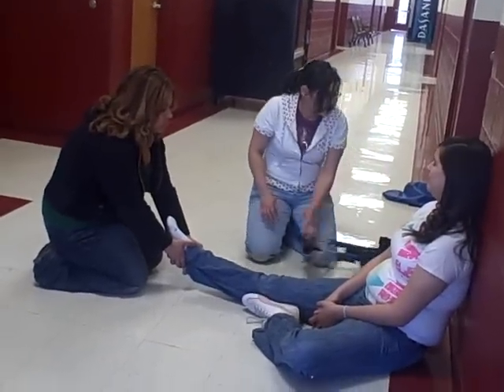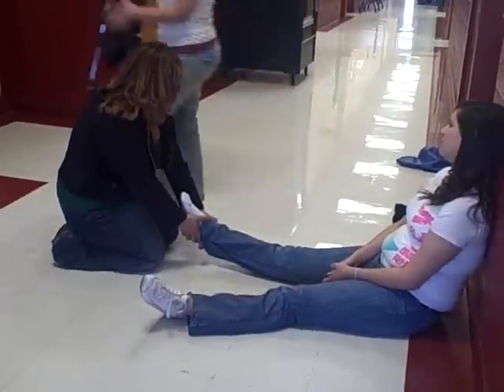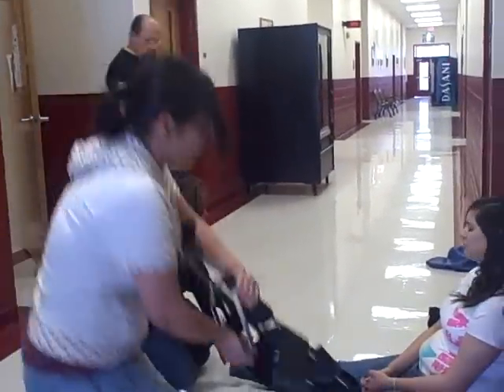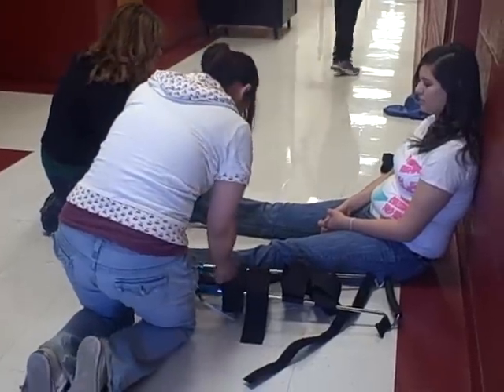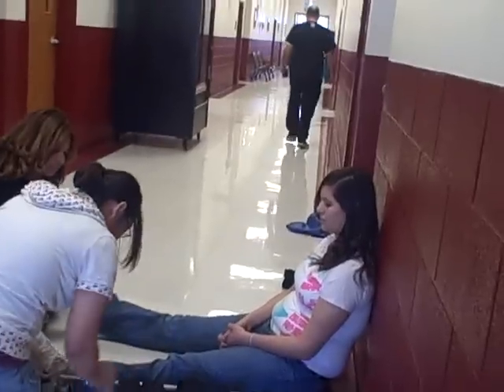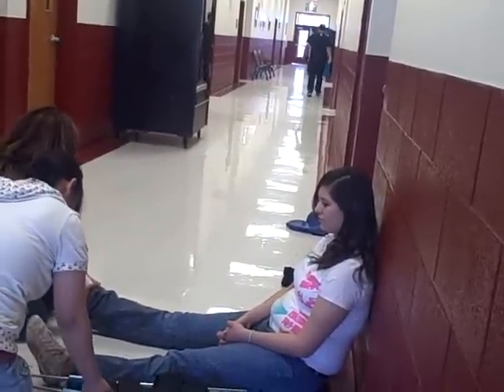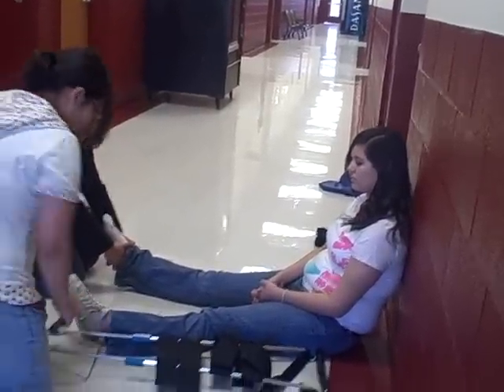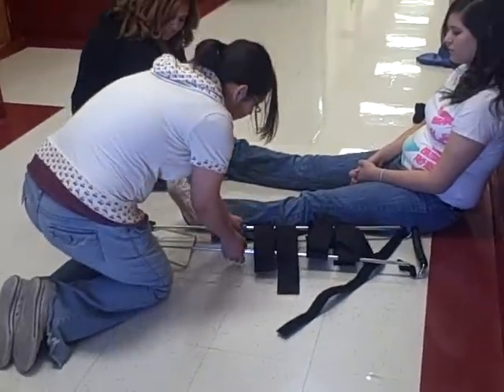I'll continue by measuring my traction splint, measuring the proper size of it on my non-injured leg. It should be around 6 to 10 inches past the heel of the foot. It's about right, so I'll lock it.